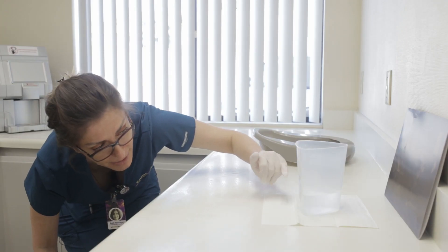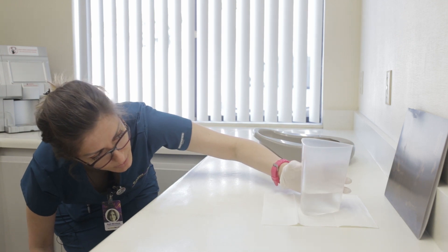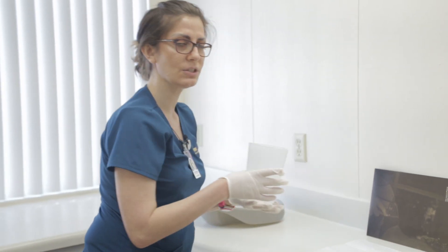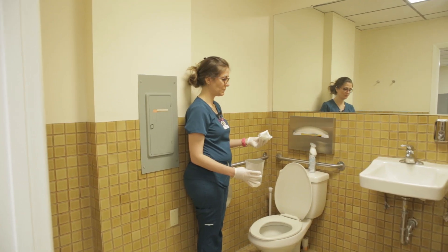If the measurement falls in between the lines, round it up to the nearest 25 milliliters. In this case it reads 250 mL. Now that you have your number, you are ready to dispose of the contents in the toilet.